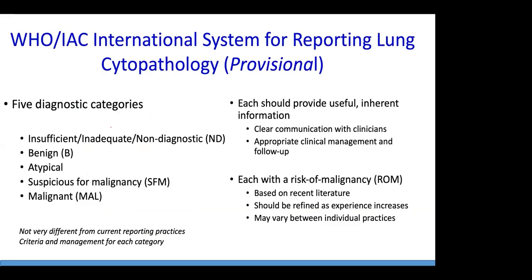Which categories? So there are 5 diagnostic categories: insufficient, inadequate, non-diagnostic; benign; atypical; suspicious for malignancy; and malignant. They are not different from the current reporting practices, but for each category, we provide criteria and the management for these categories. These result in clear communication with the clinicians and, of course, appropriate management and follow-up.